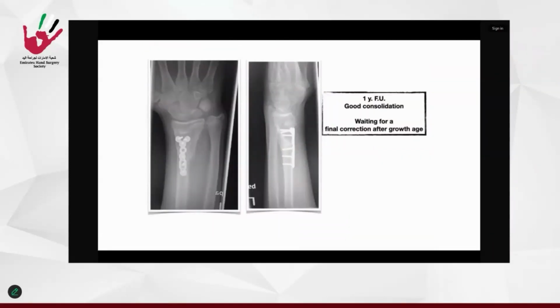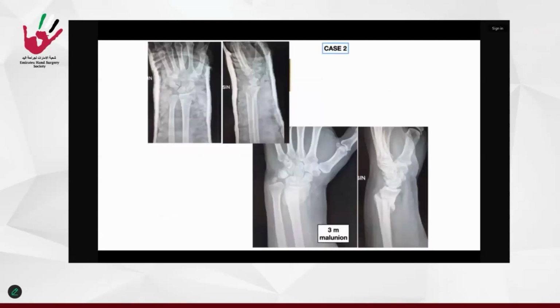And this is the follow-up at 1 year of this temporary correction, waiting for definitive correction after the growing age.